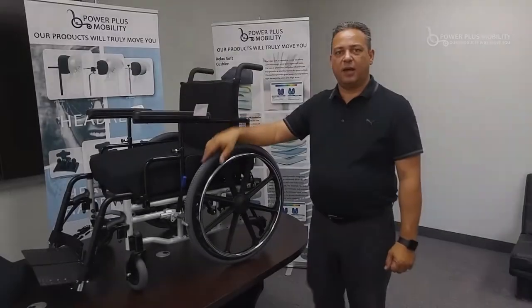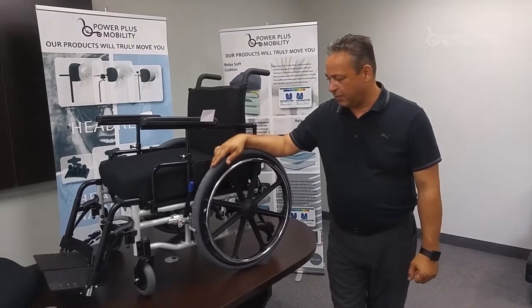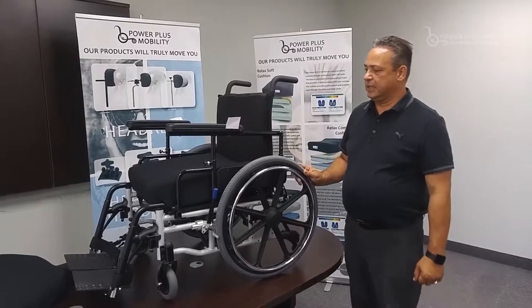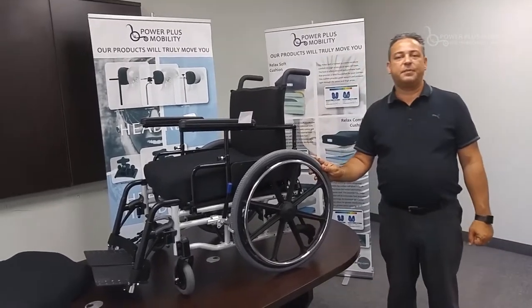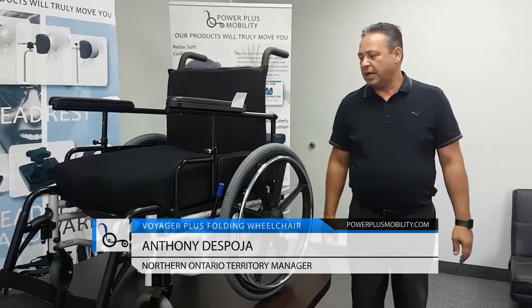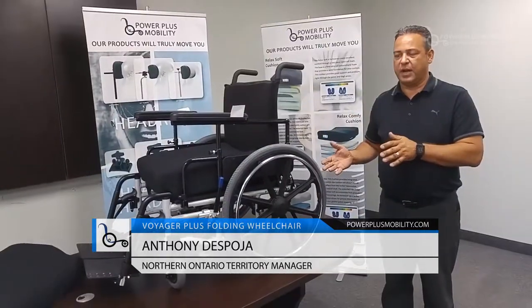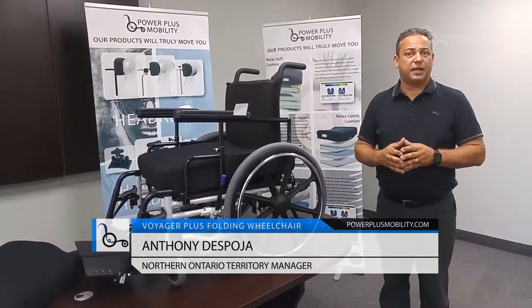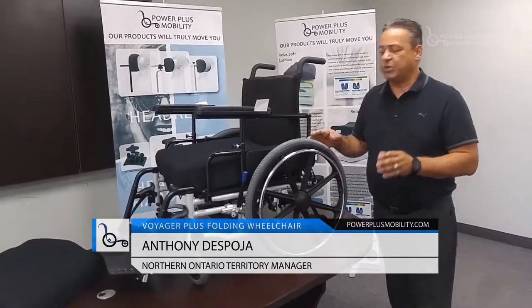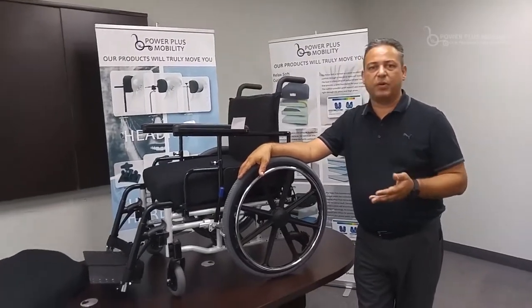Welcome back to Power Plus, another product session with our fully manual chair, the Voyager Plus. The Voyager Plus is predominantly a Type 2 chair here in Ontario, sold coast to coast in Canada. The real big difference between this frame and any other frames that we manufacture is that this frame is a steel frame. The reason why we make this steel frame is we want the durability of the chair.